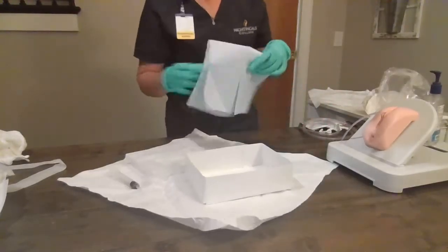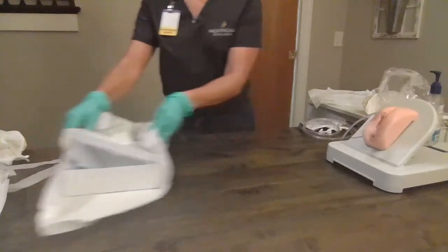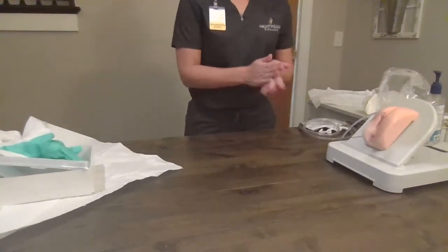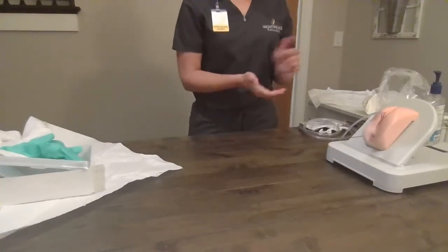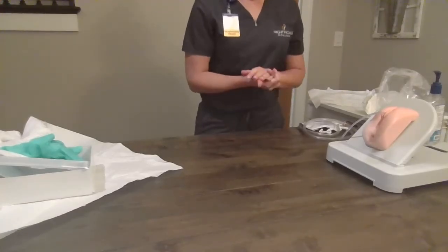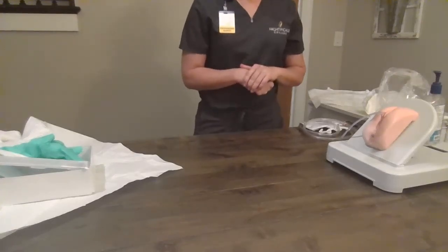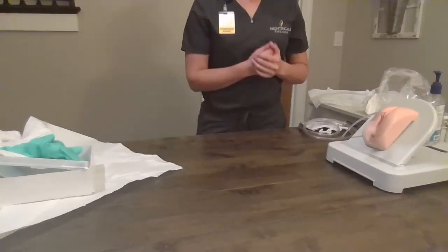We're going to clean our supplies and discard in the trash. Remove our gloves and perform hand hygiene. Ms. Smith, are you comfortable? I'm going to cover her back up. Please use a call light if you need to get up for whatever reason. If you're going to move around in bed, make sure there's enough slack in that line that you're not going to pull it. Let me know if you get any discomfort, and I will come check the drainage bag in a bit. If you don't have any questions, I'm going to go document my procedure.